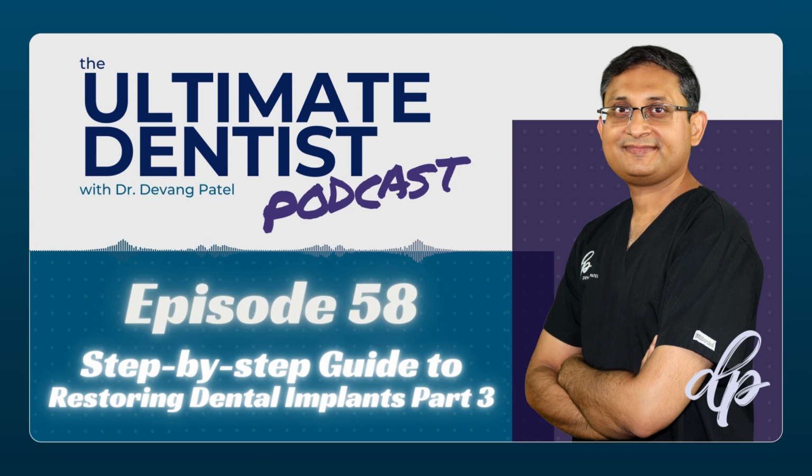And this is the cheapest way to make a screw retained crown, because many times the stock abutments are not that expensive, and they can mill the crown quite cheaply, then create a hole and just cement the crown in the lab. And this is where the problem lies. If your technician is using just stock abutment Ti bases, they are generally very, very short.